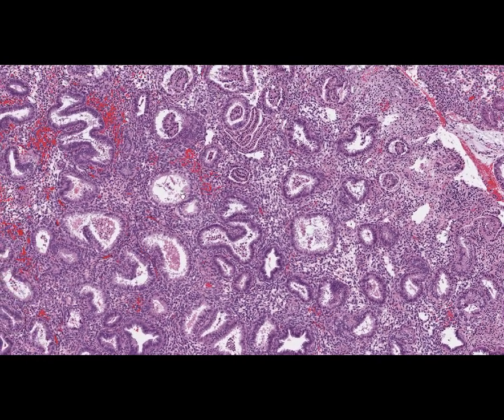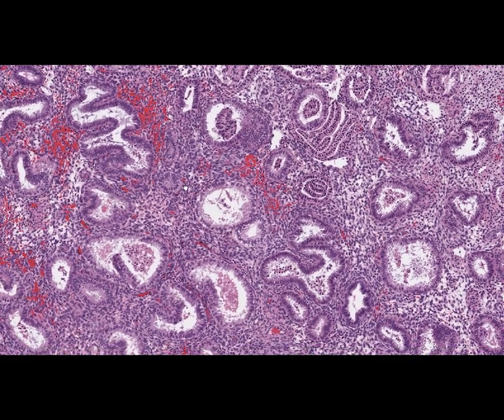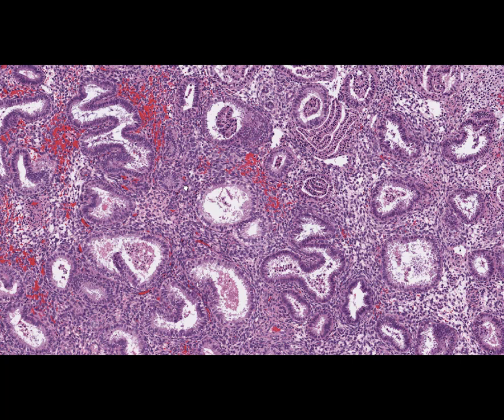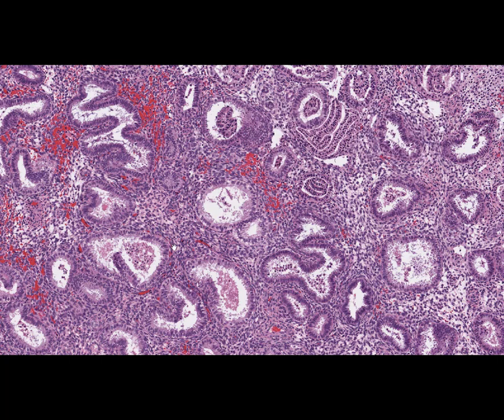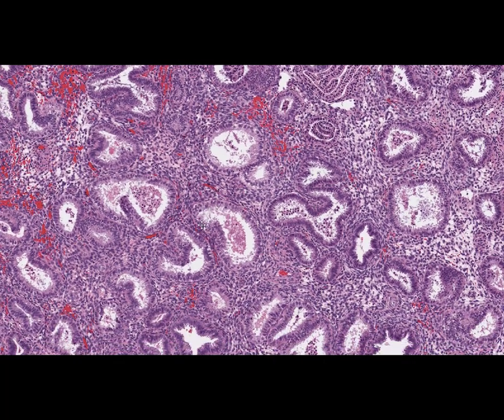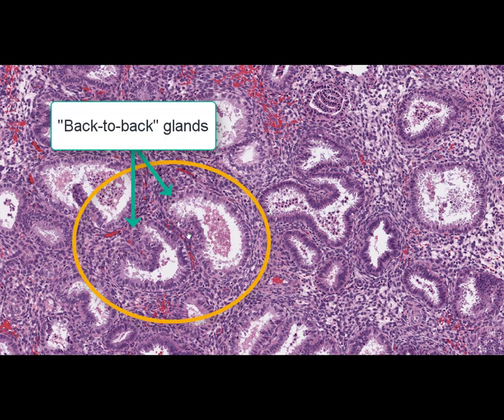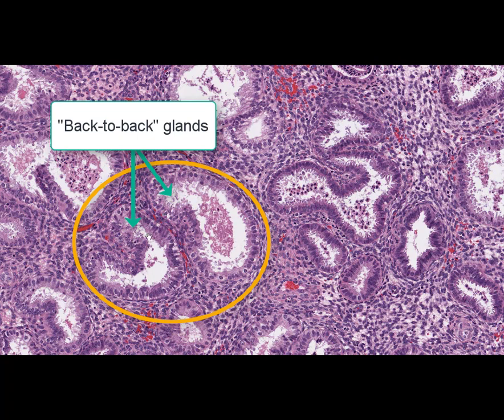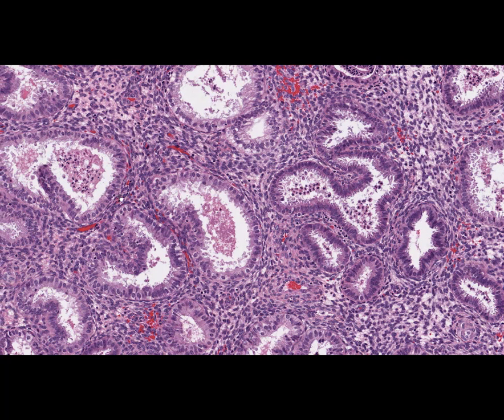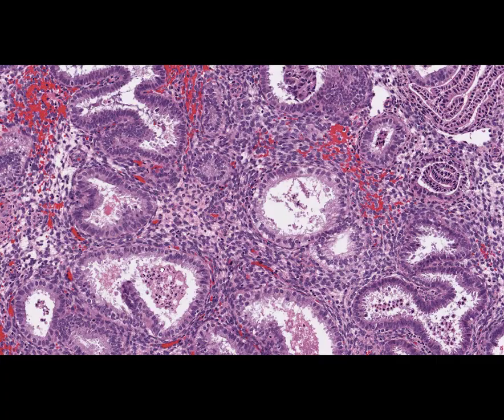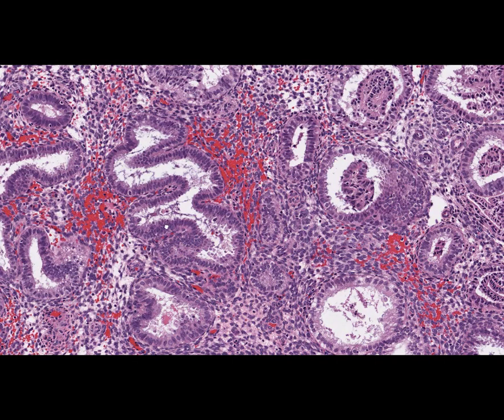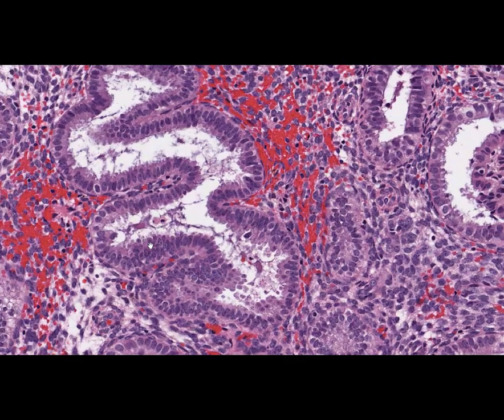At high magnification, we can observe typical glandular formations of the endometrium with several peculiarities in their structure and location relative to each other. Firstly, some glands have a twisted appearance and are called corkscrew-shaped glands. Due to the increased number of glands, some are allocated too close to each other — such glands are known as back-to-back glands. Epithelial proliferation in some glands shows the appearance of pseudostratified epithelium, where epithelial cells seem to be located in a few layers.